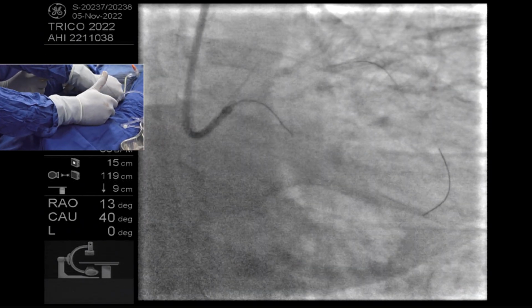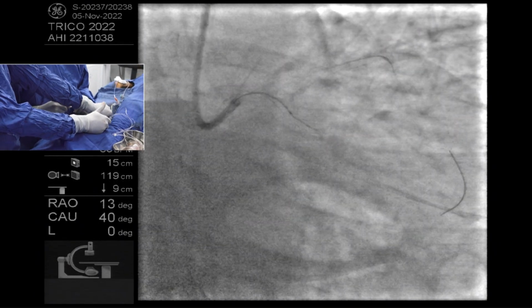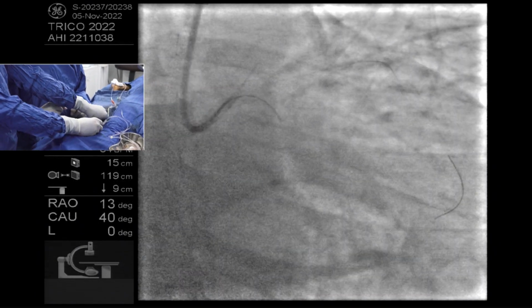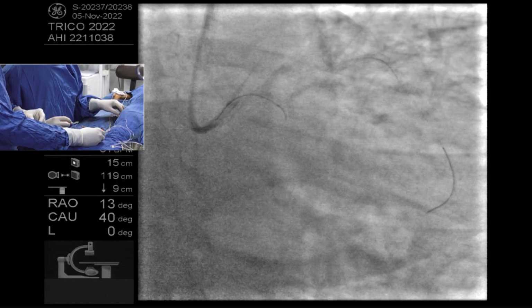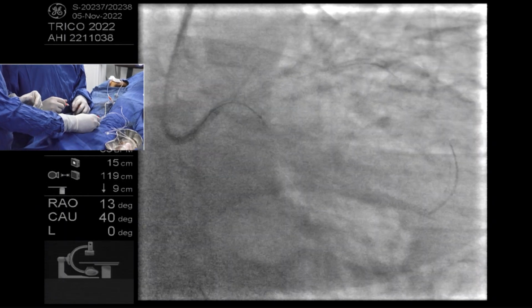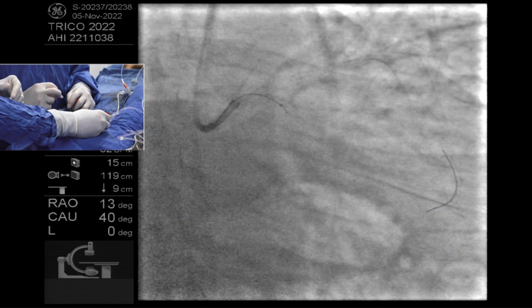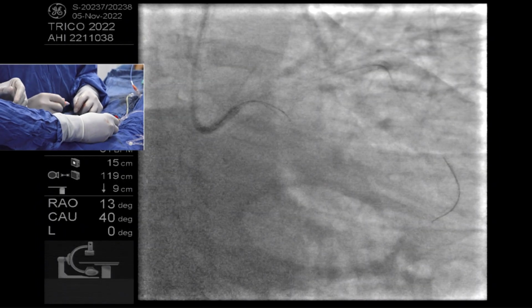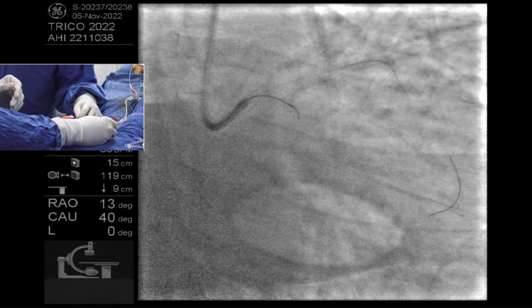The only catheter that could offer some support here is a catheter with a side hole, because then you could get the wire to exit outside there and have the support. It's the closest way you can get to that. But to be honest, in my experience, I almost never have used it. But this is the case that could help.